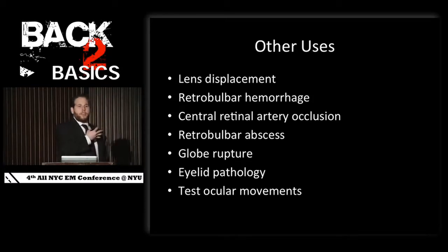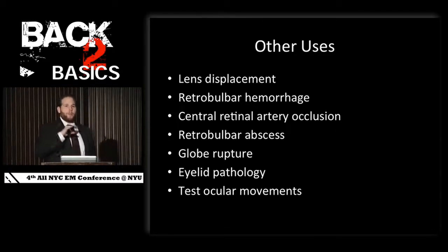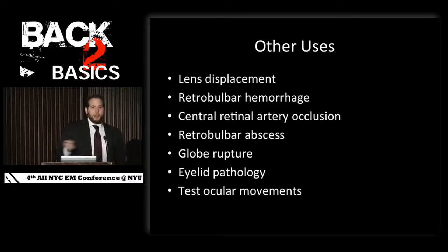And then you can even just test extraocular movements. Like the image I showed you of the guy with a big swollen eye, it's really hard to kind of dig your way in there. You can just have them move their eye on the ultrasound. You'll be able to see it move up and down. And that's pretty much it.